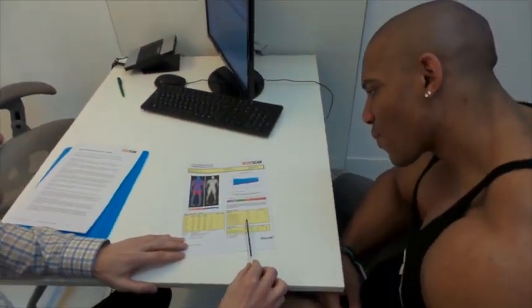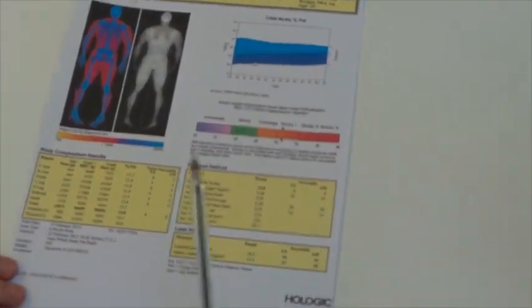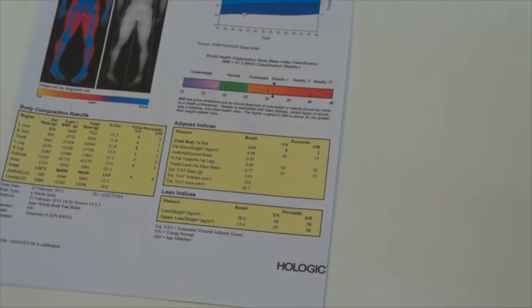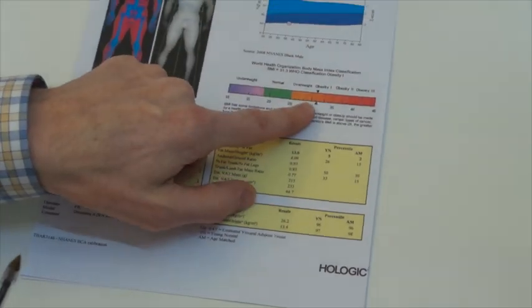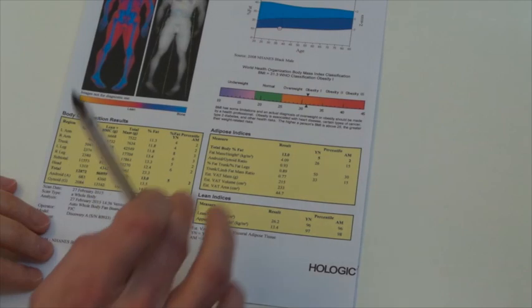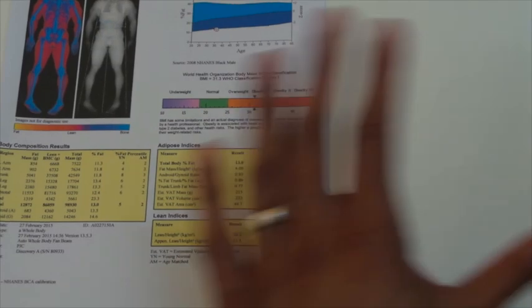So here in this table down here, we've got some indices, some number crunching based on your adipose tissue, your fat. And the beauty of DEXA is because we isolate fat and we isolate lean, I can have a pretty good idea of what you look like just by looking at these numbers. With a BMI, I have no idea. If somebody gave me this BMI, I don't know whether you look like you or whether you're seriously obese until you walk in the door. But with these numbers, I have a much better idea. It's almost like someone else could do the scan and give you the report, and you can have a visual already.